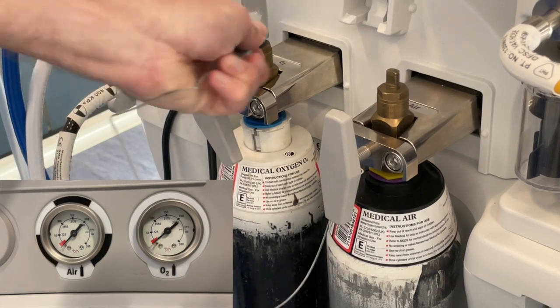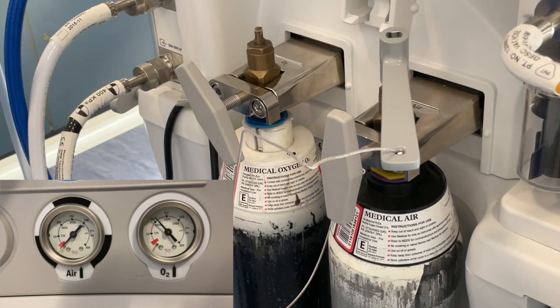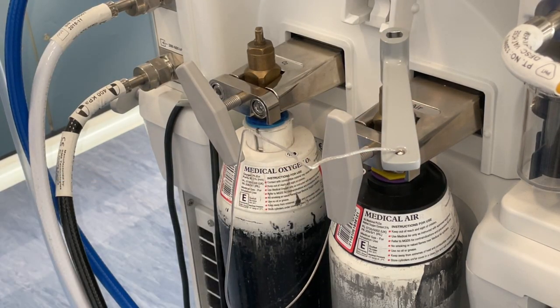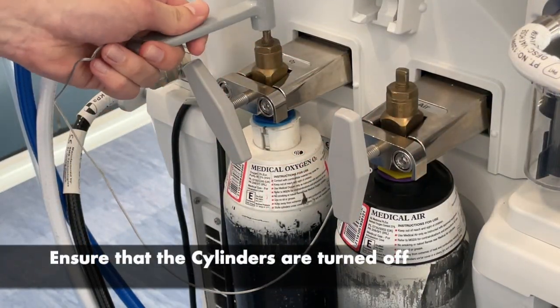Open the cylinders and check their contents using the corresponding gauges. The pressure within a full oxygen cylinder is approximately 137 bar. Once checked, it's vital that the cylinders are then turned off.